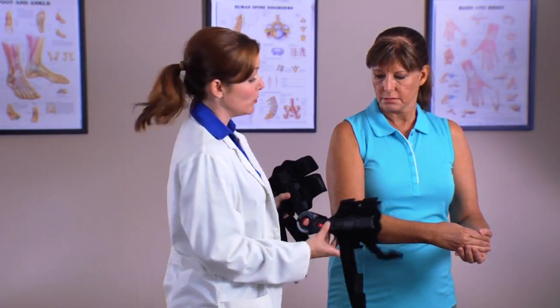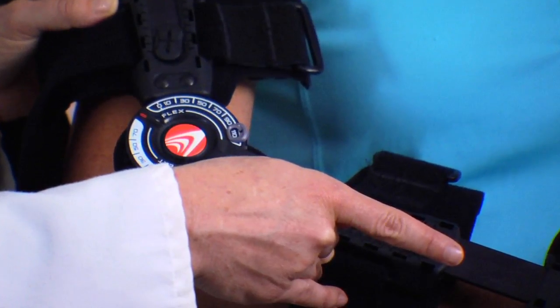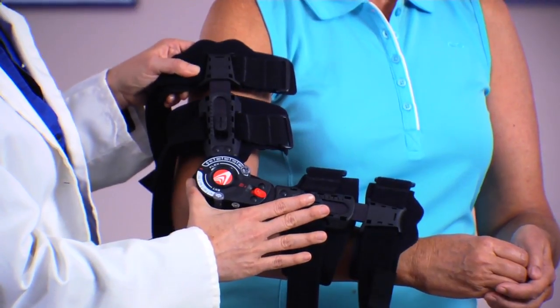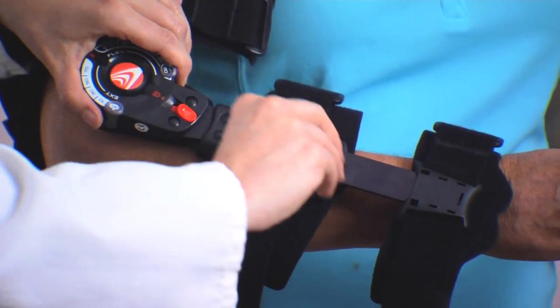Hold the brace up to the arm with the hinge centered over the elbow joint. The quick lock on the hinge must be facing the patient's hand for proper orientation. Slide the telescope bars until they match the length of the upper arm and forearm. Lock the telescope locks by rotating clockwise.